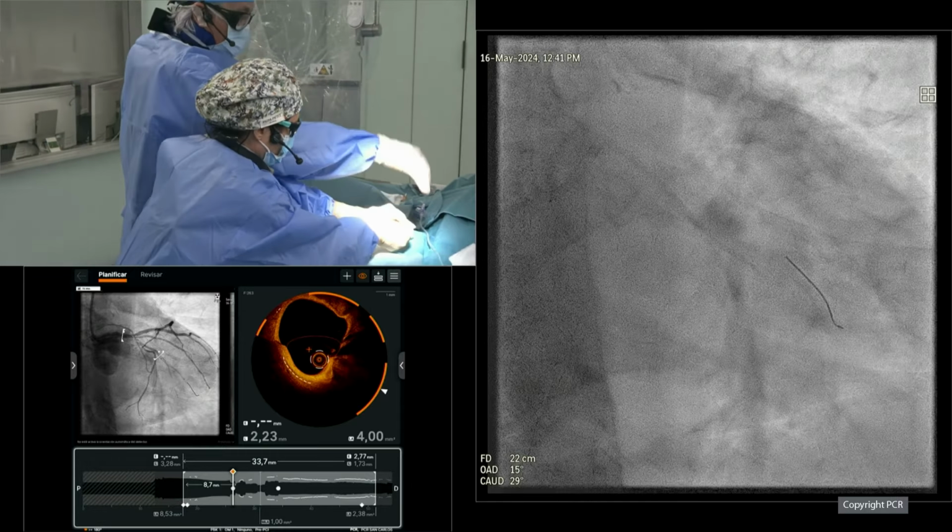Can you hear the sound? We can. Which speed is this, the slow speed or the high speed? This is 80,000. This is the low speed. Okay. So next thing is Nieves is going to help me with this.